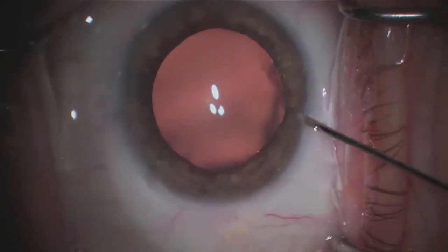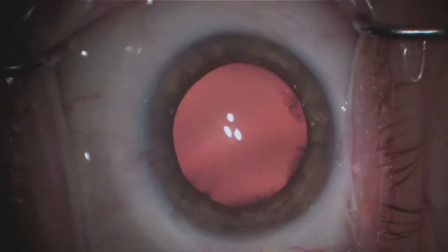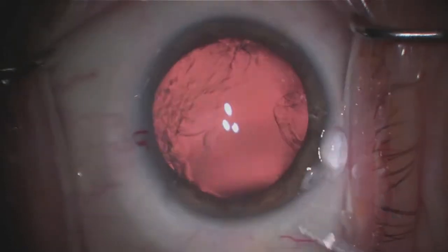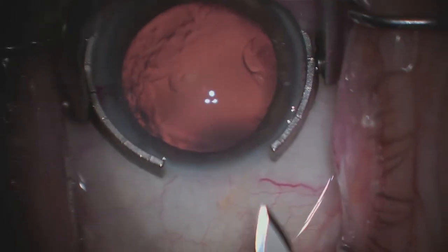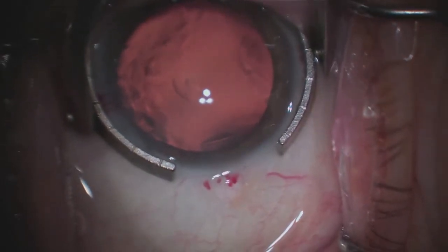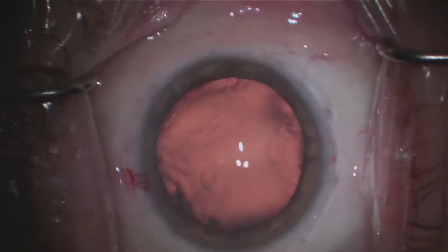The first steps involve creating two openings inside the eye so that I can place instruments in the eye to begin removing the cataract. The next step is placement of a thick, transparent gelatinous substance, which gives you some working space in the front of the eye. Then comes the creation of the main wound — a temporal incision where the opening is created on the side of the eye closest to the ear.